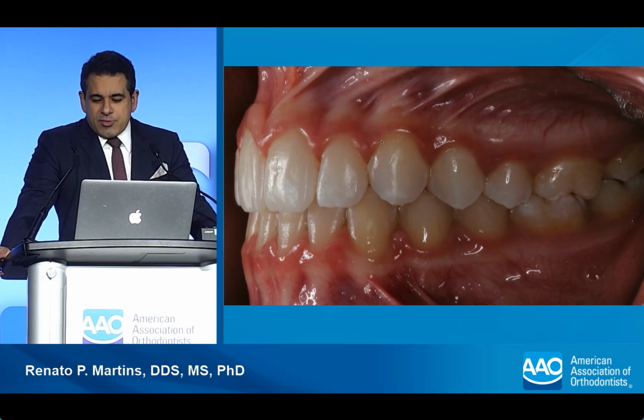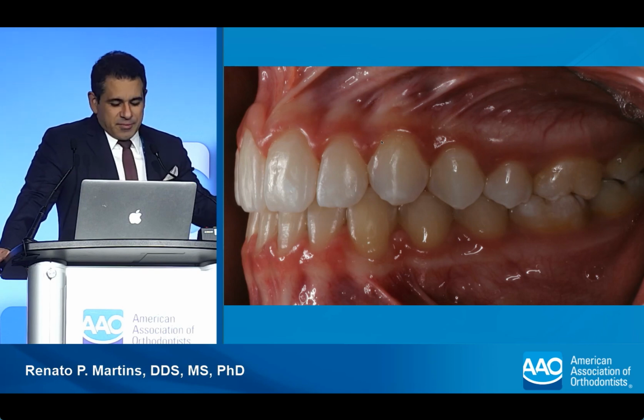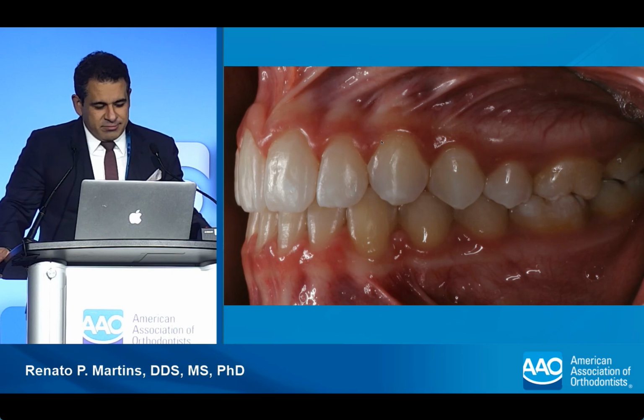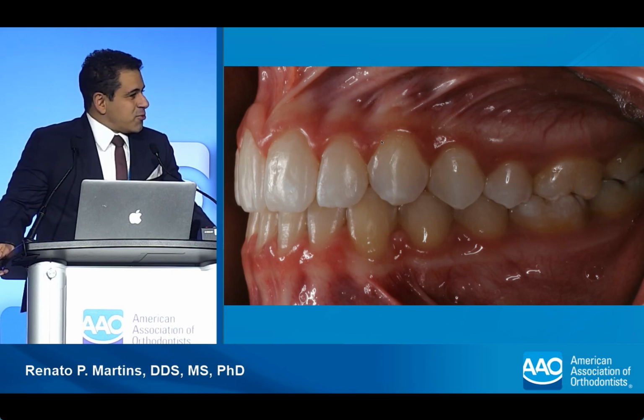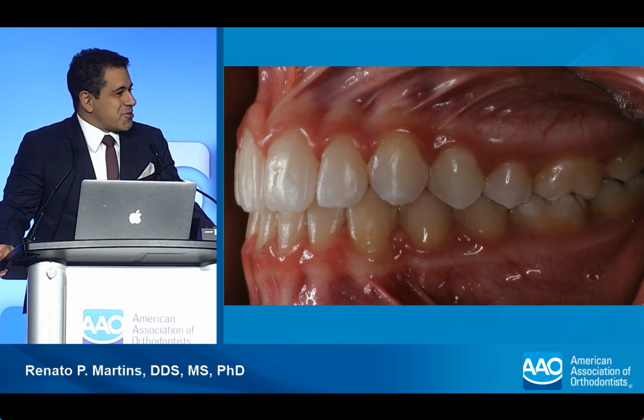Because once you get to the chief complaint of the patient and you take care of it, the patient wants to remove the appliances. They just drop out of treatment. So you probably have the same issue, right? So this is the daughter of a good friend of mine. I really, really wanted to bring the canine down. She said, "Uncle, no, treatment's finished."